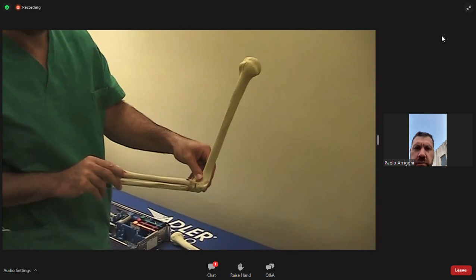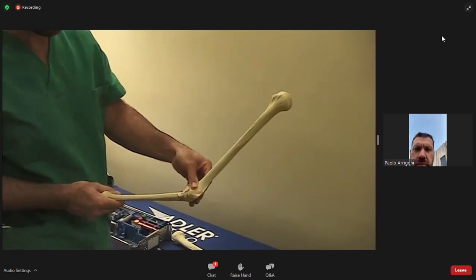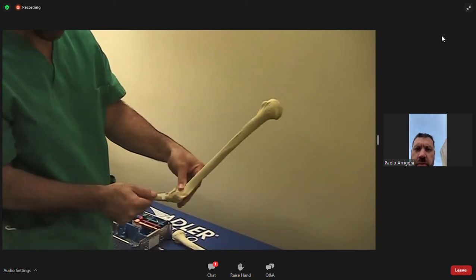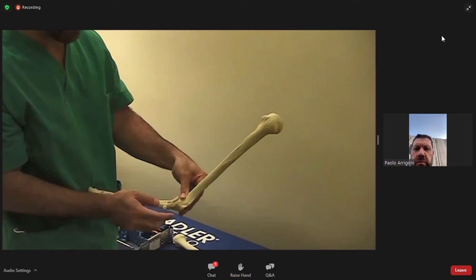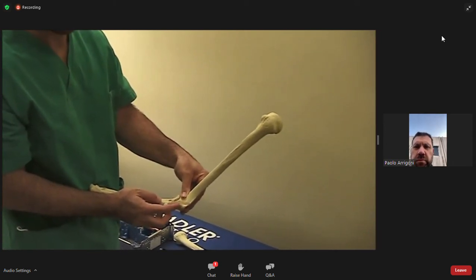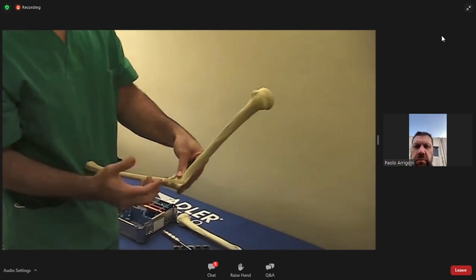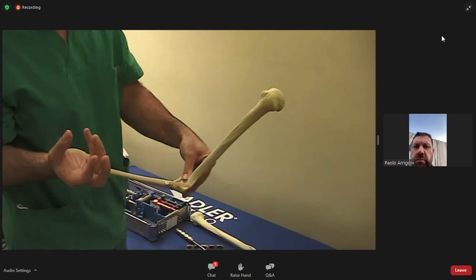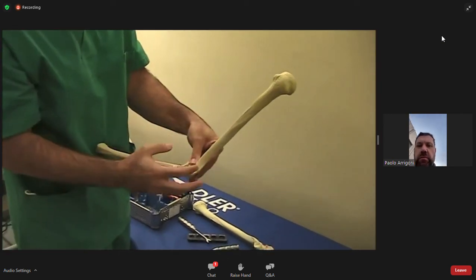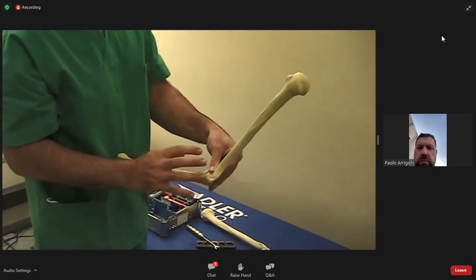If you really want to test the stability of the system, go into extension, 30, 40 degrees, full supination, and push on the radial head posteriorly. In this way, you will understand that you need the ligament to be reattached. Otherwise, everything is going to be unstable. The prosthesis itself is an easy prosthesis to implant. The difficult part is to understand the whole joint and the soft tissues around it, which have to be completely considered and resutured at the end.